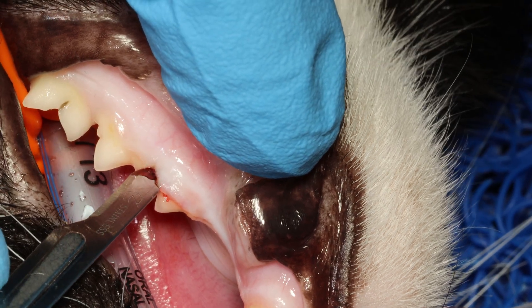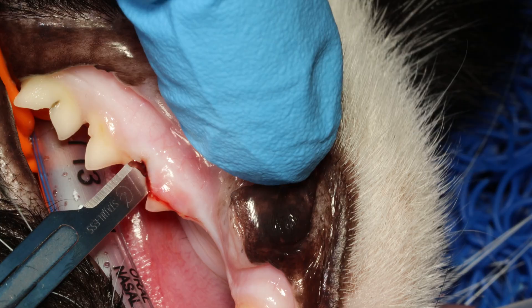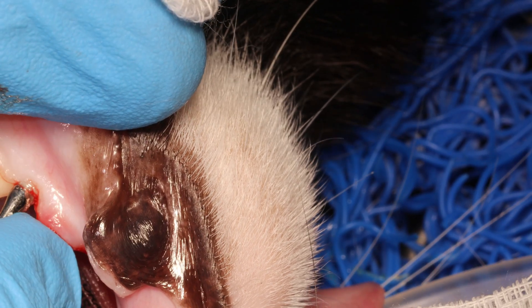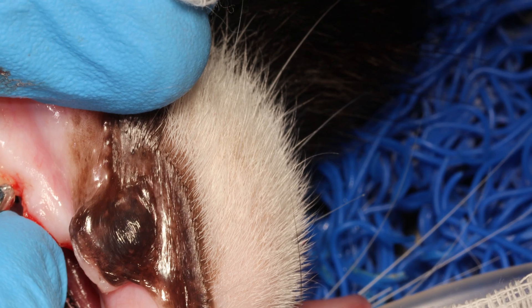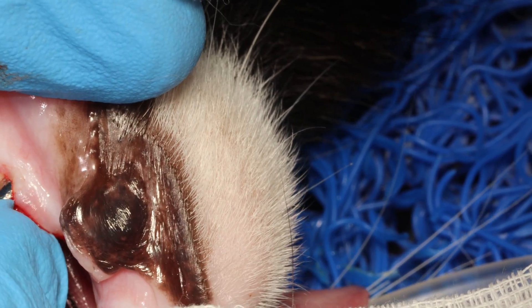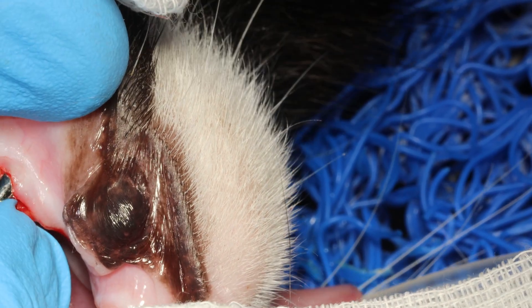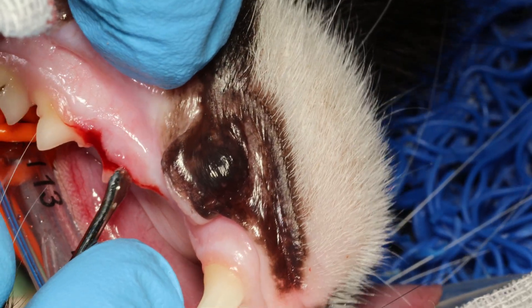I start my envelope flap here with a size 15 scalpel blade. I use a feline small periosteal elevator to gently pry the gingiva off of the bone. You have to be very careful and put firm, controlled pressure onto the bone while you are twisting the periosteal elevator to twist the gingiva off from the bone.